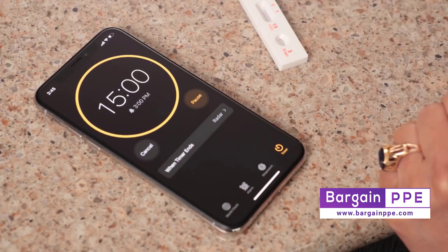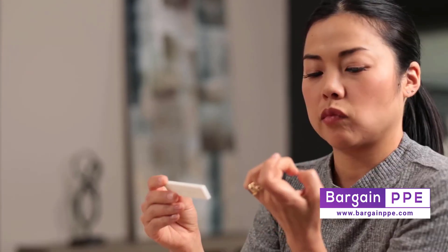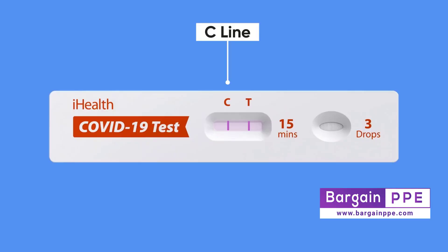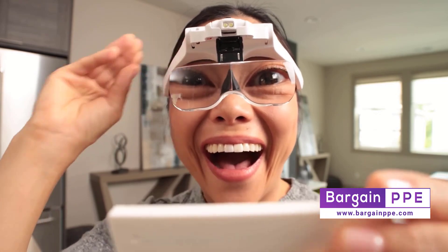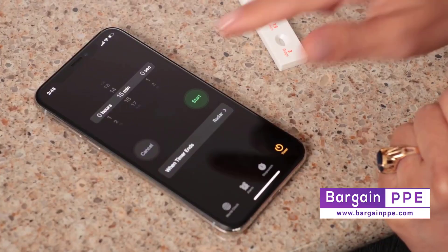Set a timer for 15 minutes. You'll see your sample being slowly absorbed into the test strip. Over the next 15 minutes, your results will appear on the test strip as lines under the C and potentially the T. After 15 minutes you can officially read the results of your test, but be aware you only have another 15 minutes to read them before the results are officially considered invalid.